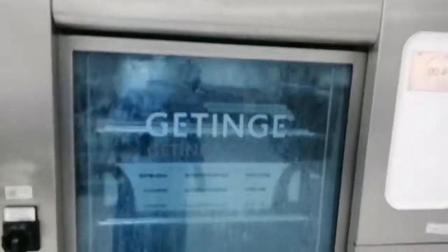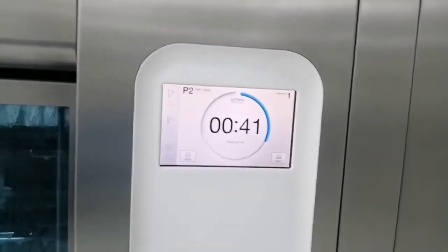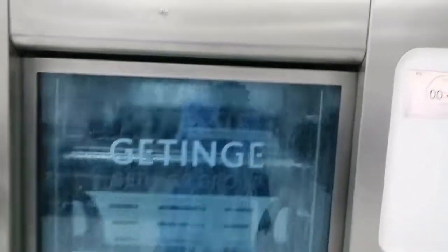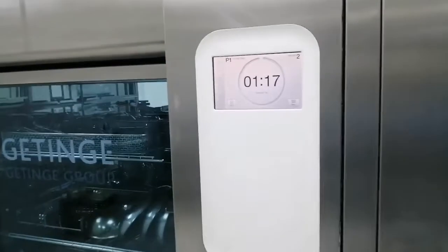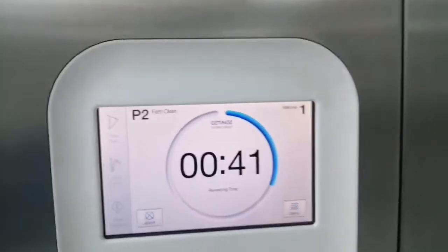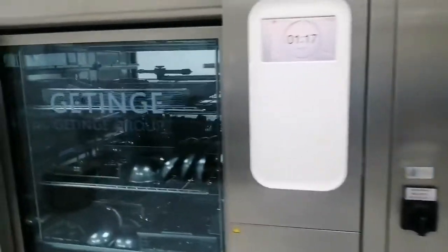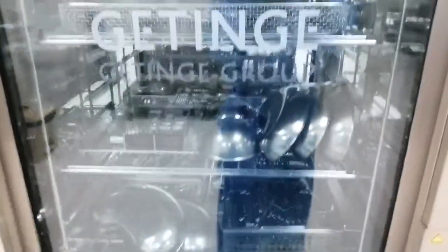The heavier instrument sets can be placed on the lower level of the washer disinfector. The lighter sets must be put on the higher level, and the heavier sets on the lower level. In the middle, you place the bowls or kidney trays. I put some kidney trays lower because there was no space.